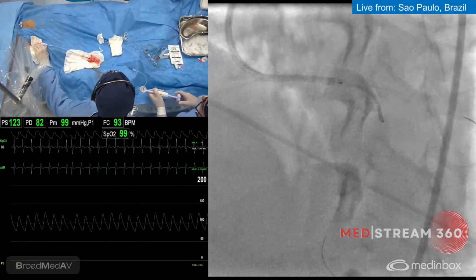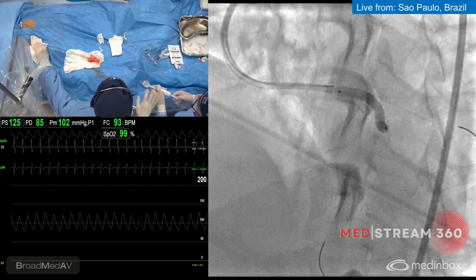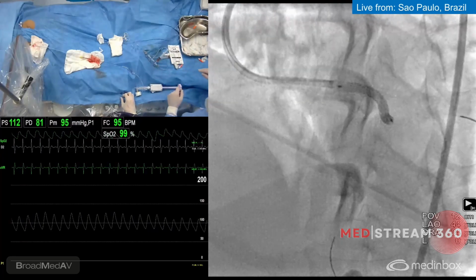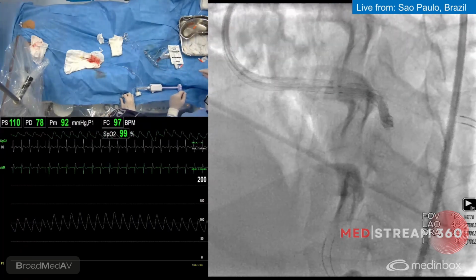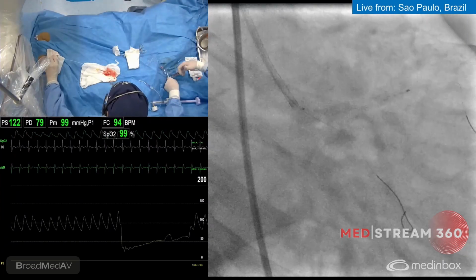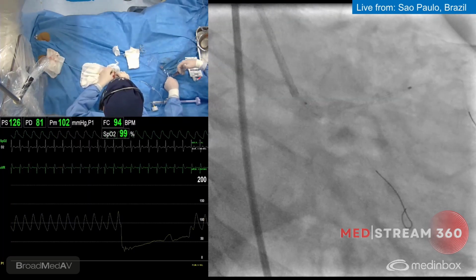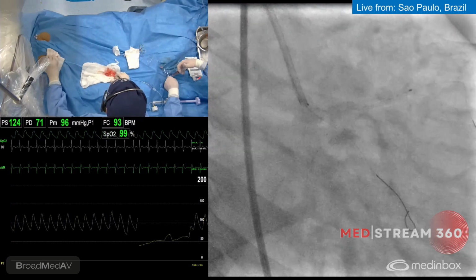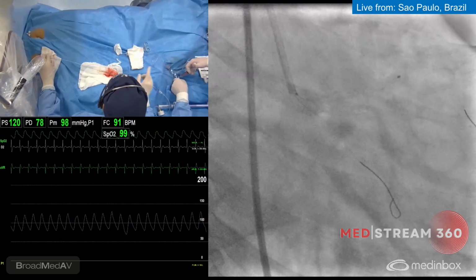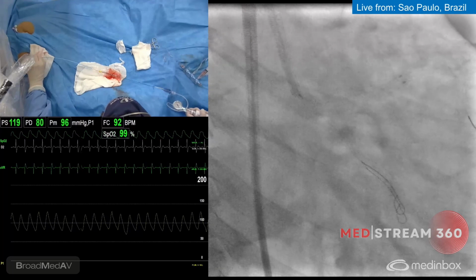Now we inflate the balloon in the left main. 10, 12. Needs to be a short inflation, short time. So 12 here. Okay, 12, and deflate, down. So now we can use the same balloon here without moving the balloon, to check where you deploy the stent. Is that correct? Yes. So I'm pulling now the guiding catheter with my left hand, and I'm pulling the balloon just to avoid the guiding catheter touching the struts here. Very important. So I'm using the same balloon here, Ricardo, to do some post-dilatation, okay?